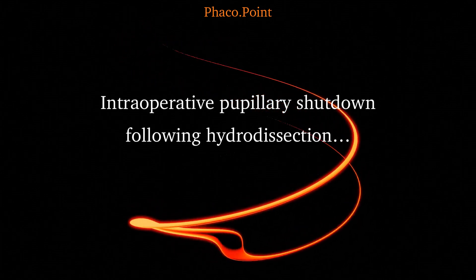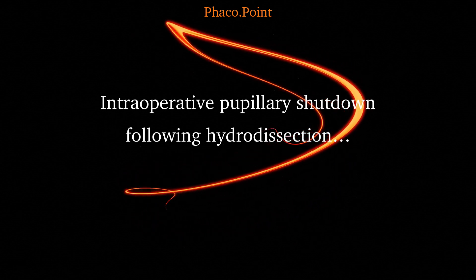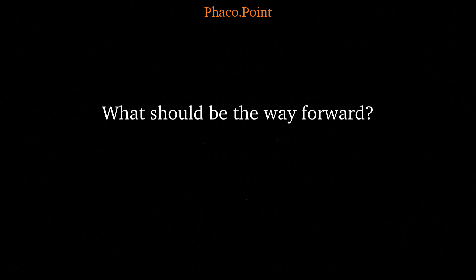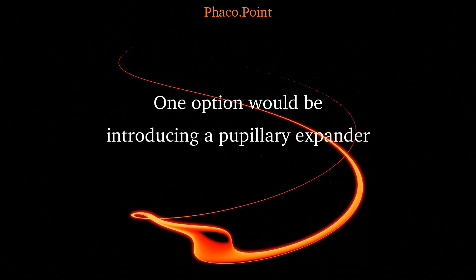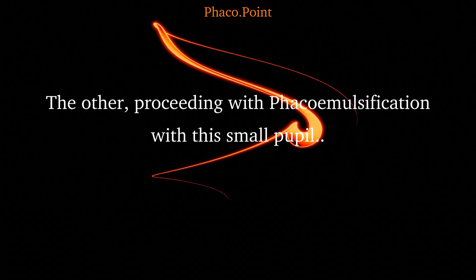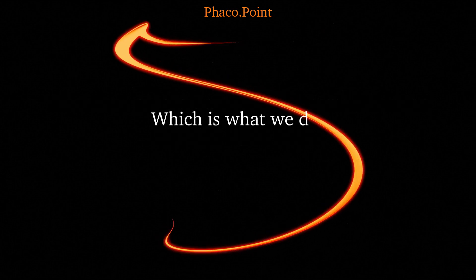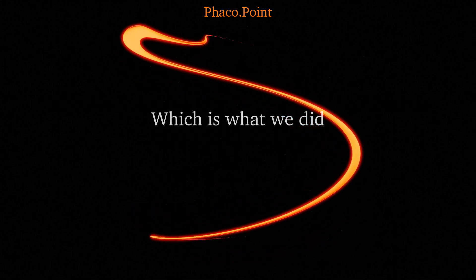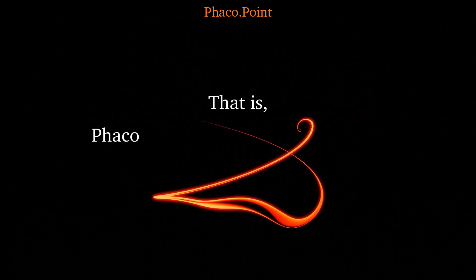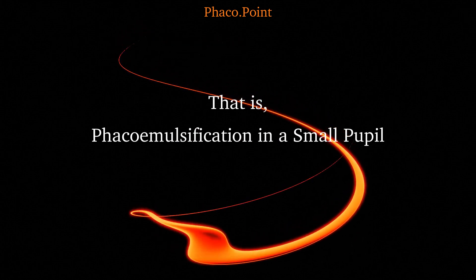I'd like to discuss this case wherein after hydrodissection the pupil shuts down. In a scenario like this, what should be the way forward? One option could be the introduction of a pupillary expander. The other would be to proceed with phaco-emulsification with this resultant small pupil, which is what we actually did. Let's now understand the principles of nucleus management in a case of performing phaco-emulsification in a small pupil.